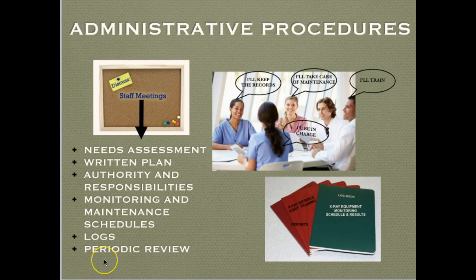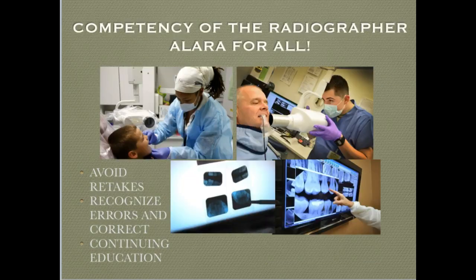And you should have a periodic review of all of these areas that you are going to implement and maintain in order to have a quality x-ray area in your dental practice. Certainly, we want competency of the dental radiographer, which will achieve ALARA, as low as reasonably achievable, for the patient and for the dental assistant or the dental healthcare worker.